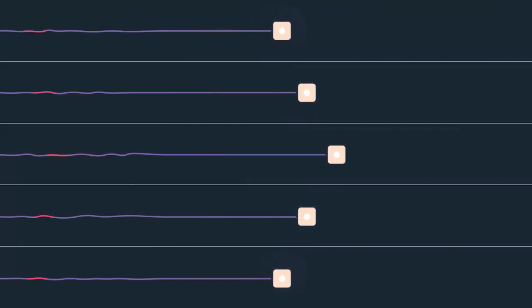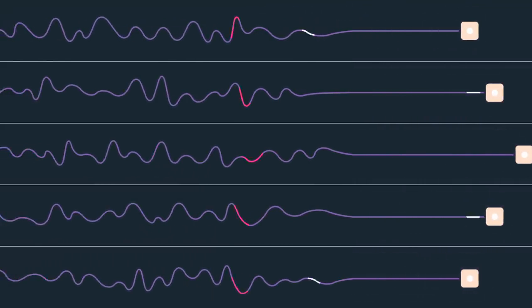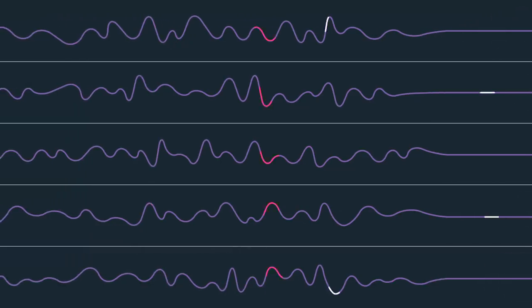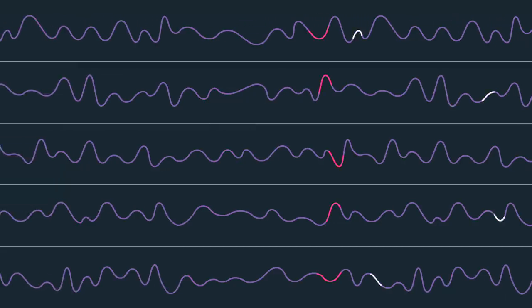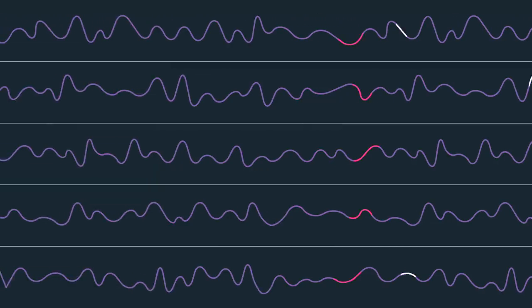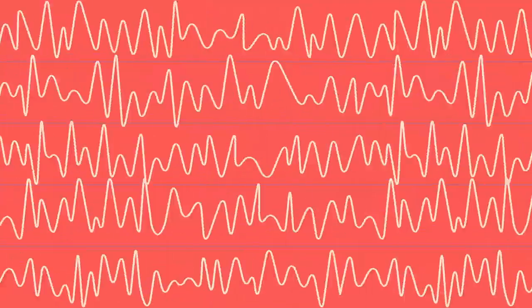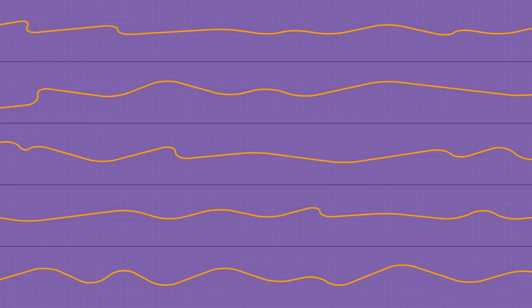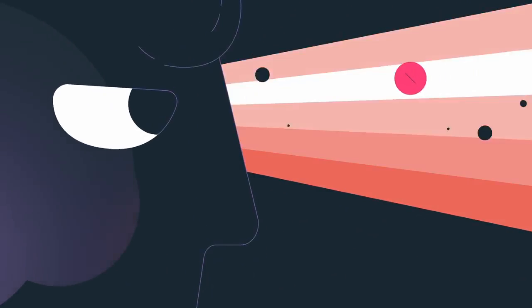First is EEG, or electroencephalography, which measures electrical activity in your brain. As brain cells communicate, they produce waves of electricity. Electrodes placed on the skull pick up these waves, and differences in the signals detected between electrodes provide information about what's happening. This technique was invented almost 100 years ago, and it's still used to diagnose conditions like epilepsy and sleep disorders. It's also used to investigate what areas of the brain are active during learning or paying attention.